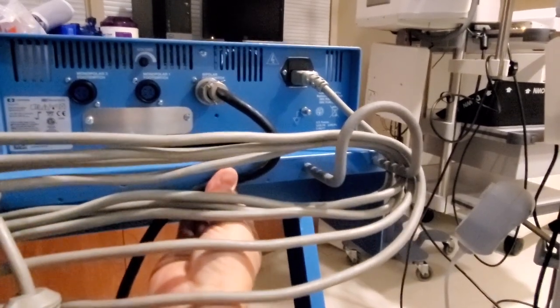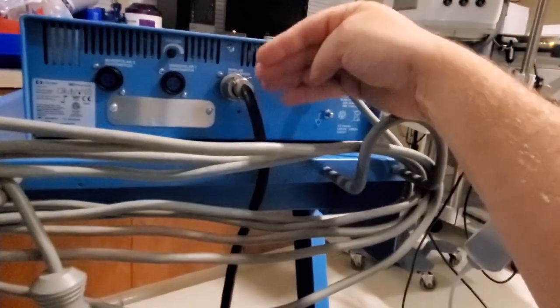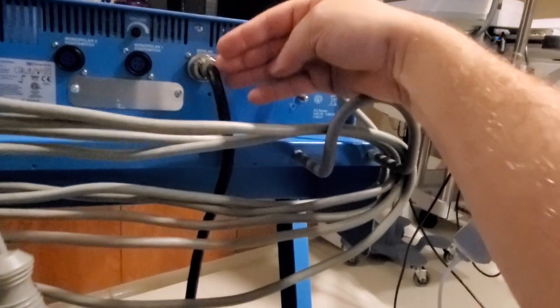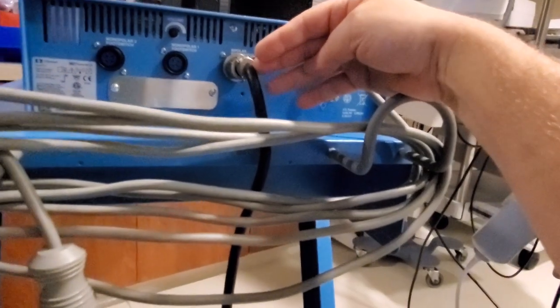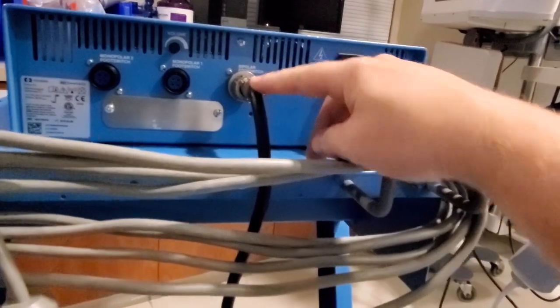Put a zip tie through it right there. Now your strain is on the zip tie and on the cord instead of at the connector. This is the weak point at almost every single cable. And if that's not the weak point, this is the weak point. It's always where the soft cable meets a rigid structure. So that's your weak point.